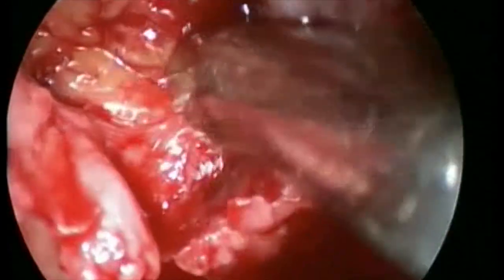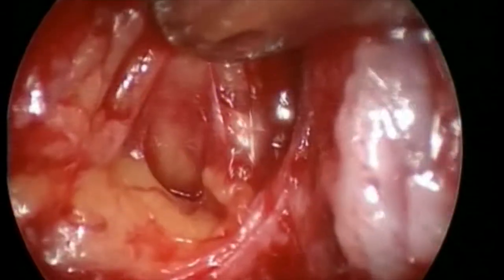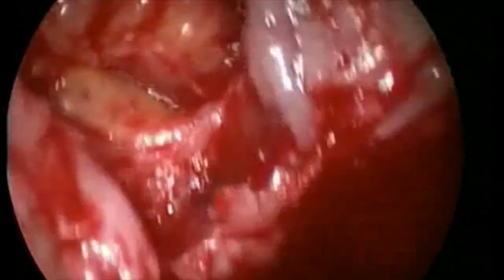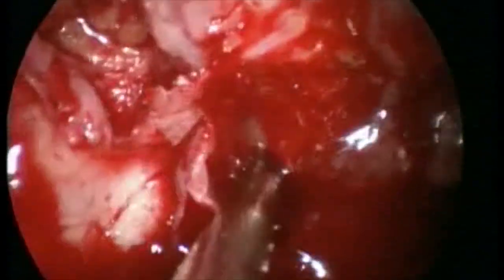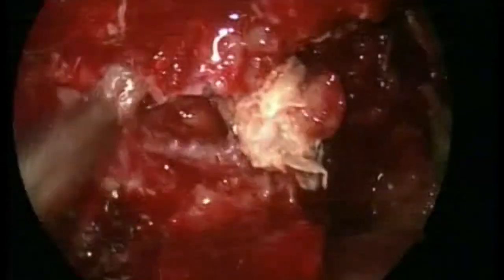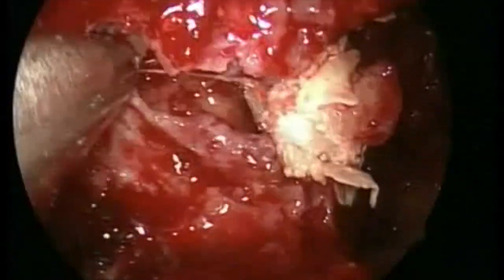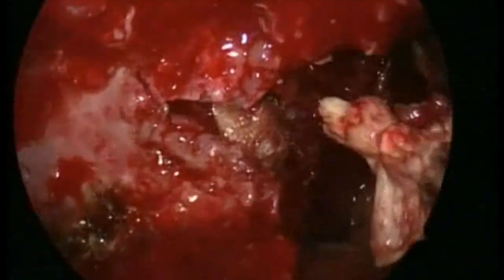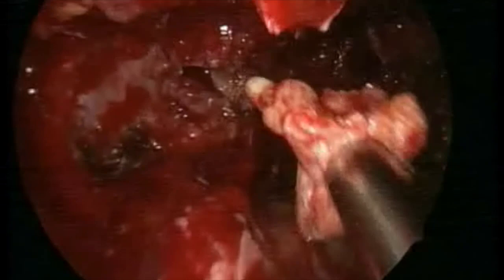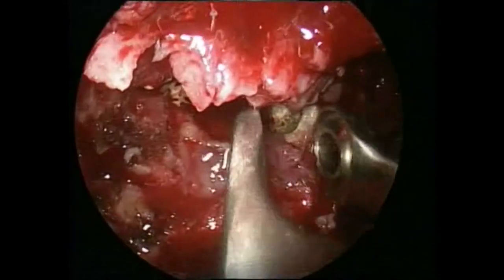Going into the right orbit — that's the inferior aspect of the orbit. You are seeing healthy orbital fat and the muscles there. That's the roof of the maxillary sinus. And now that's the pterygopalatine fossa of the right side. We are removing the fungus from the pterygopalatine fossa. We are seeing the pterygoid bone — that's the pterygoid base.